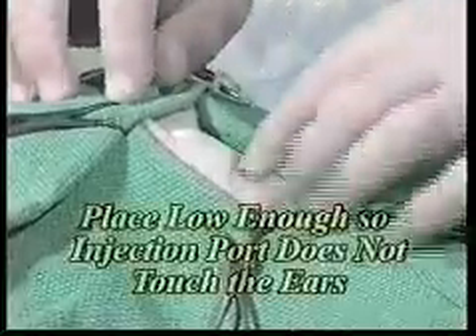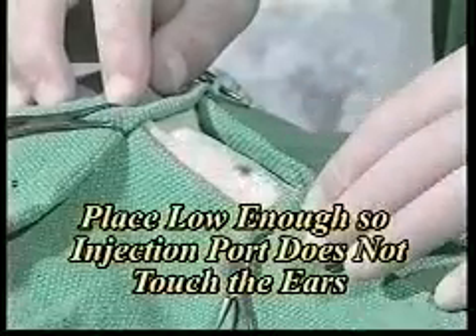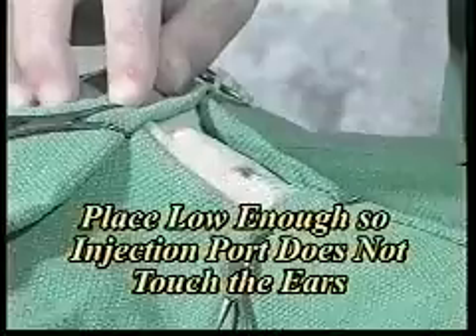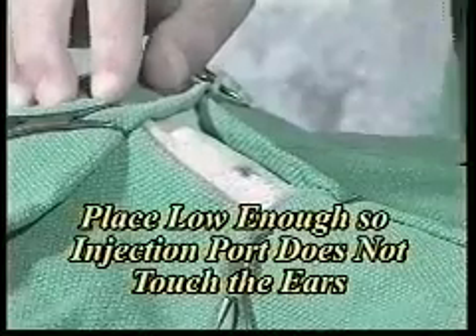This is where the tube is going to be placed on a cat. It can be placed a little further back on larger dogs, because you want the tube to extend as far back past the ribs as possible.